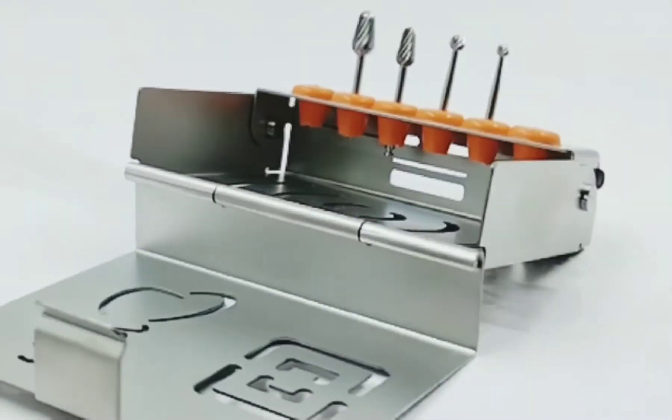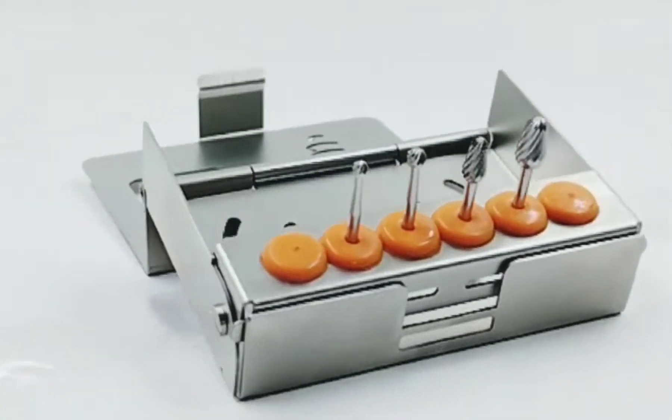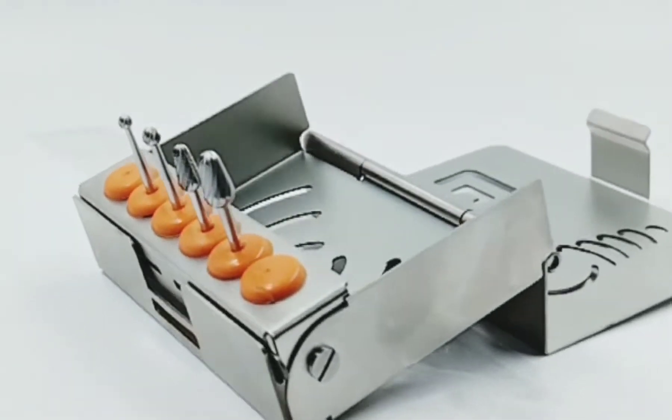Ridge Contouring Burrs. It is used in flattening and contouring the ridge to the desired result.